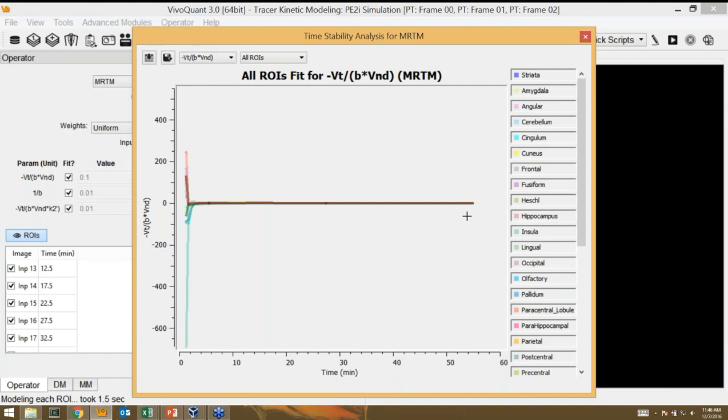The last thing I'll say about the modeling operator, and I know I've mentioned it before, but I truly can't say it enough, is that all of this is fully scriptable. It's fully script ready. So for instance, you could very easily write a script or a series of scripts to perform each model with various functions or various settings and output those results, and even in that script upload those results to the IPACs. This is all fully integrated with the IPACs for data mining and reporting.